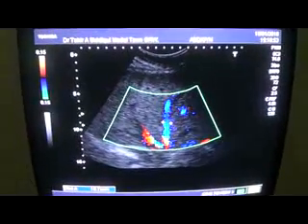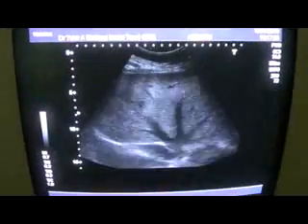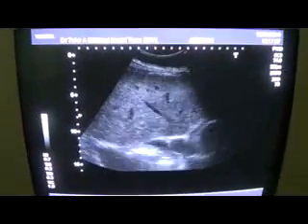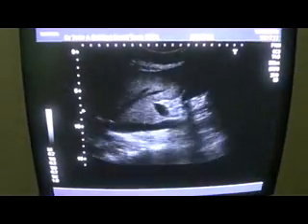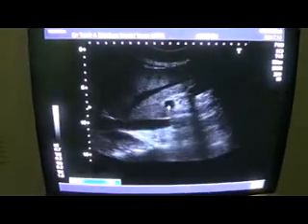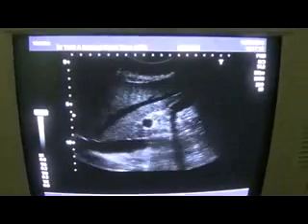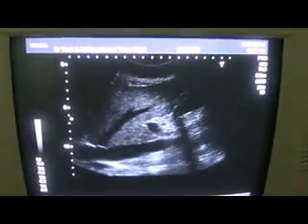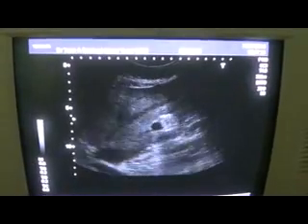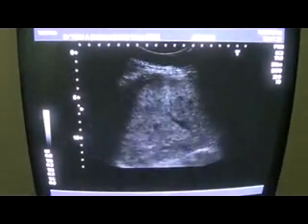More than 8 is considered to be dilated, so the hepatic veins are dilated. They give you a bunny appearance, and this is the IVC, and you can see that the pulsation of the IVC is not normal. She has a cardiac issue as well. That should be ruled out by echocardiography.